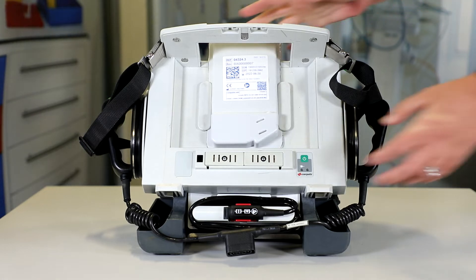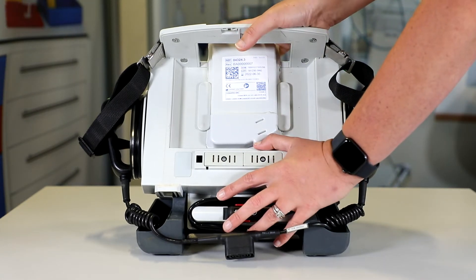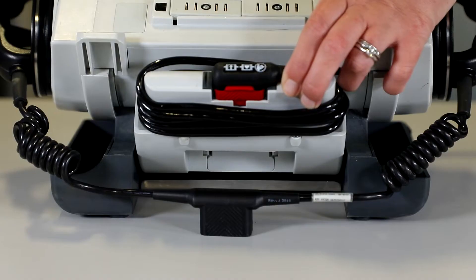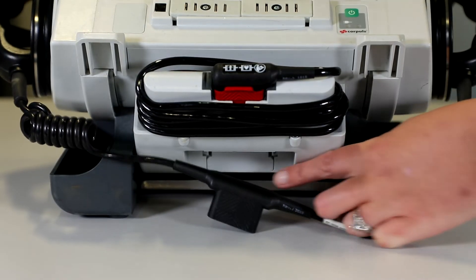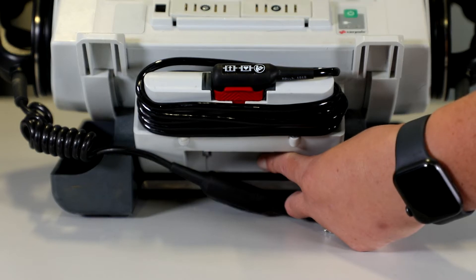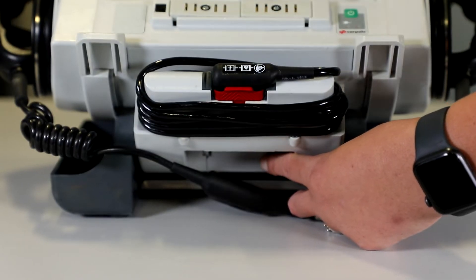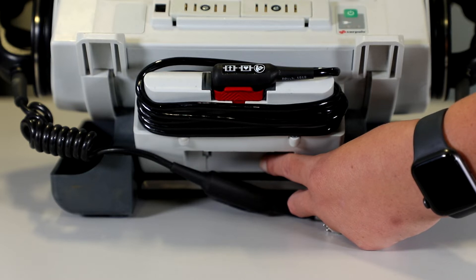Then we're going to check the tilt function on the corpuls — we just apply a bit of pressure on top and tilt it back like so. Under here is where we can find the battery for the defib, and the same things we check for this: we remove it and look for any cracks, any missing parts, any heat damage, or any leaks.